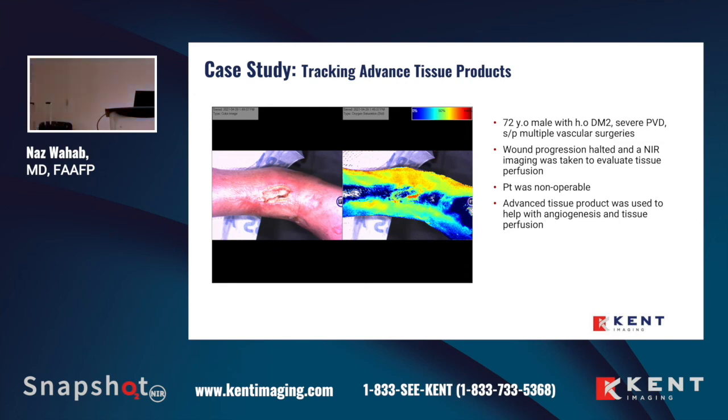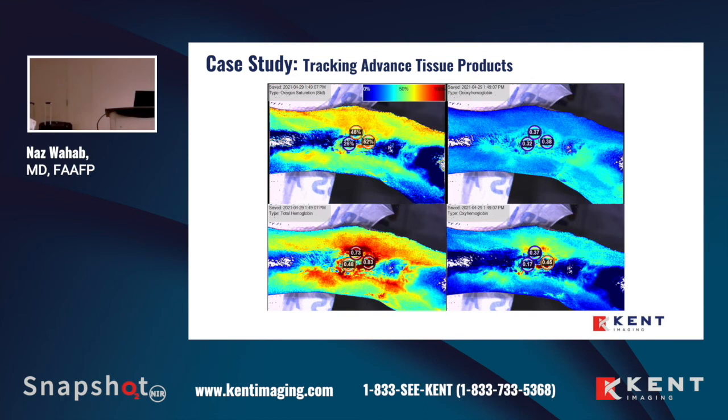I didn't know if that was just some sort of glare off of the camera, what was happening. And so I wanted to really be sure that something more was happening, and that we were really getting the depth of penetration that the machine is supposed to be giving us. And so the oxygenation was obviously not so good. But we could see the total hemoglobin was there. So I could see that I don't think this was just an error of the machine itself off of a glare, but that there was some imaging happening underneath that skin.